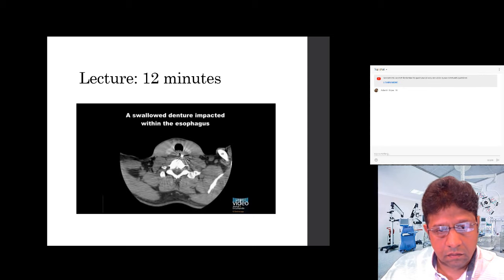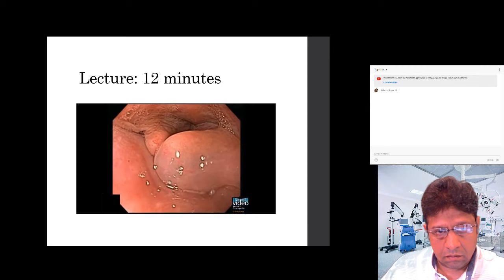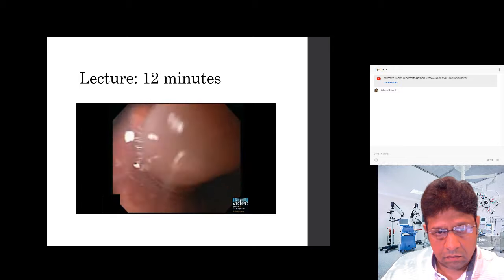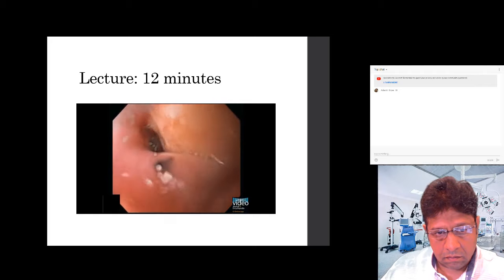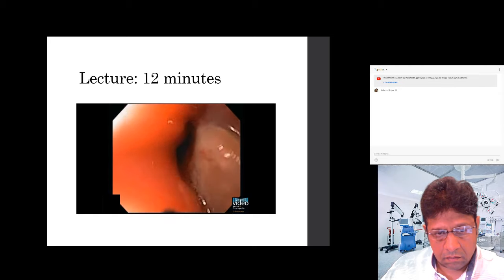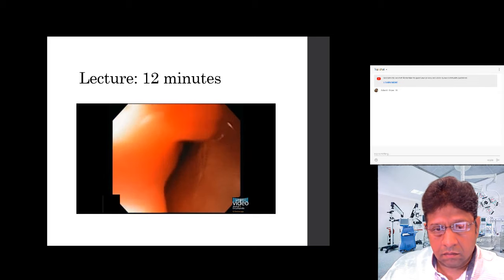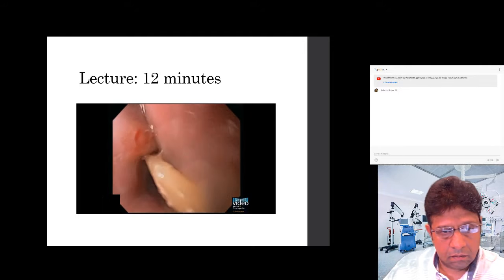This patient inadvertently swallowed a denture, and it is impacted within the upper esophagus. He cannot swallow saliva. Emergent endoscopy is performed. The denture is impacted within the esophageal introitus. Attempts should not be made to push down a sharp and impacted object.